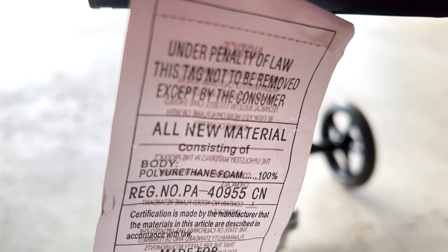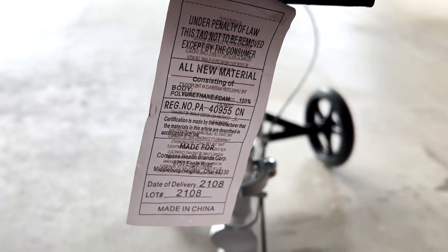It also has a detachable utility basket and a rear-facing tag that lets you know everything is up to code. But enough with the specs — let's see how she rides.